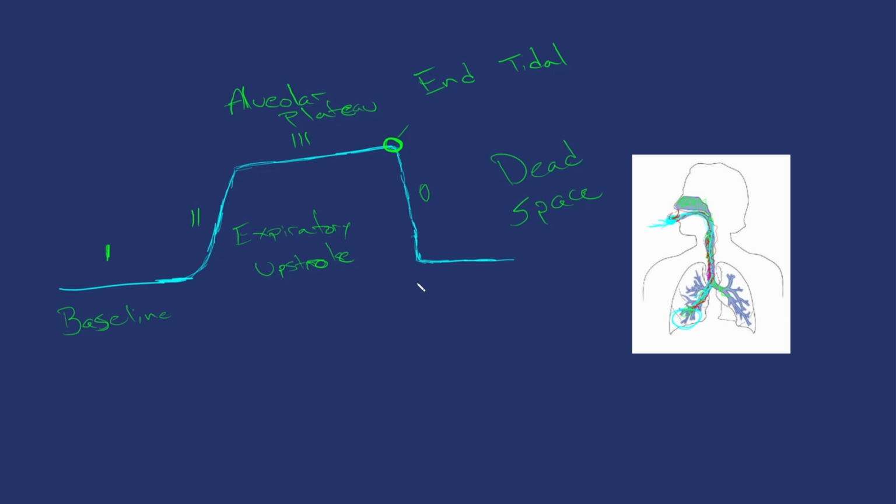And then we just rinse, repeat, again and again and again. So now let's start getting into different kinds of waves and how we can use this for determining respiratory conditions within our patient. The next important thing to look at is knowing how these can change in different physiologic conditions. So even though we normally have a wave like so, right?